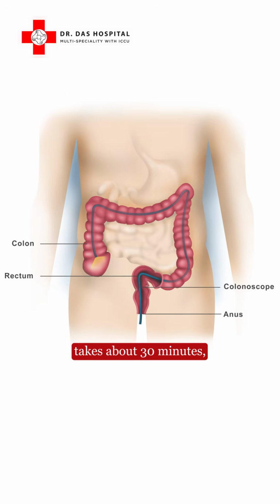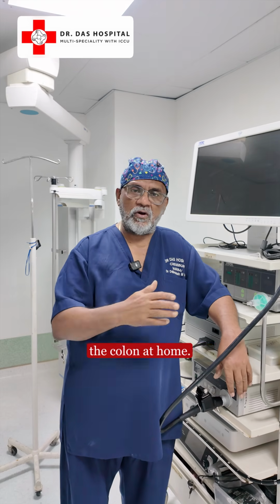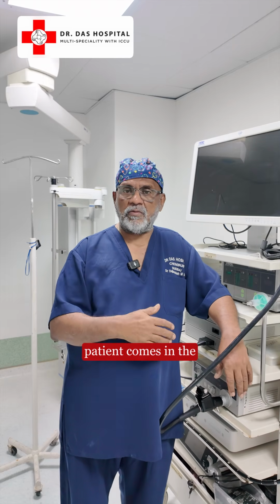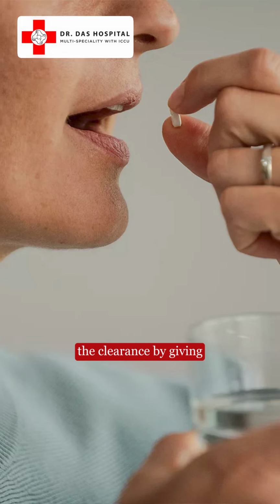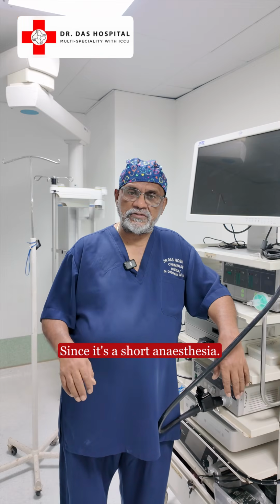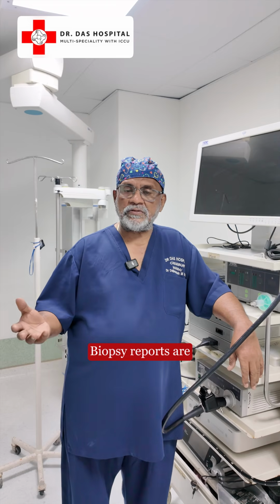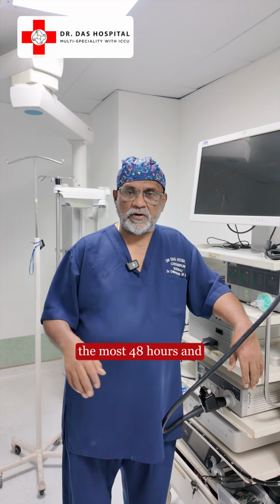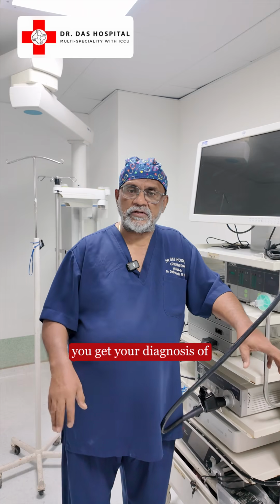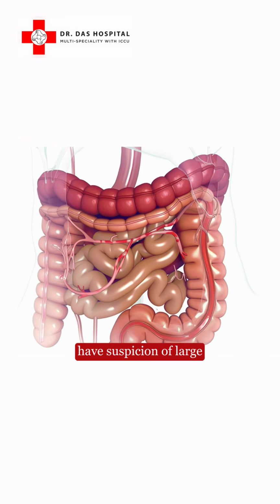Approximately the procedure takes about 30 minutes, but the patient has to come in the morning or prepare the colon at home. We prefer that the patient comes in the morning and we supervise the clearance by giving certain medicines, and then after the procedure, since it's a short anesthesia, patient waits for about 2 to 2.5 hours and then goes home. Biopsy reports are available next day, at the most 48 hours, and you get your diagnosis as to what was wrong. So these are requirements whenever you have suspicion of large intestine problem.